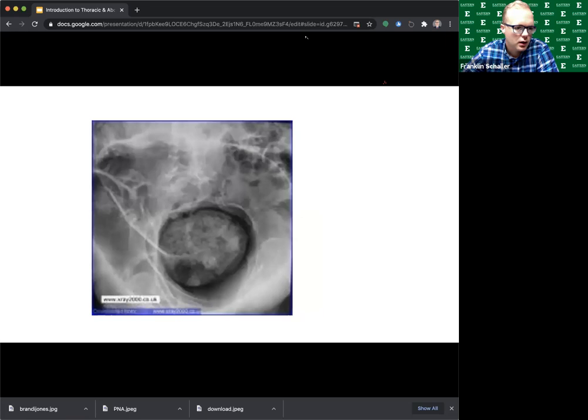Another example for you guys of an x-ray. So this is a 70-year-old female. Last bowel movement was 8 long days ago and feels pressure in her rectum. So this is an example of fecal impaction. You can see a pretty large burden of stool in the rectal vault there. And this patient is essentially full of stool. So we're going to need to prepare for manual digital disimpaction, maybe an enema or other measures to help this patient out with their acute constipation.